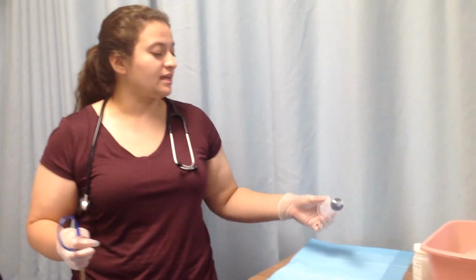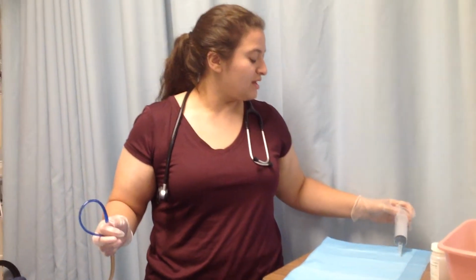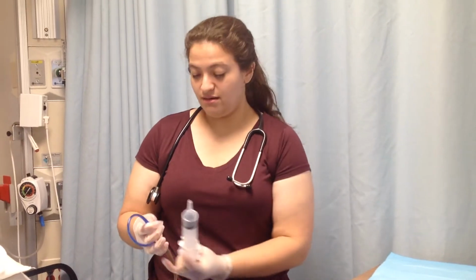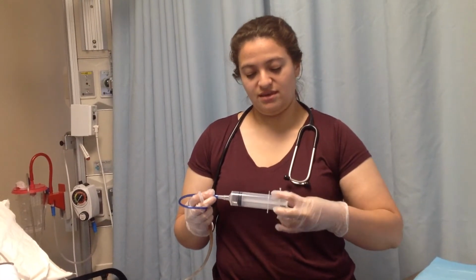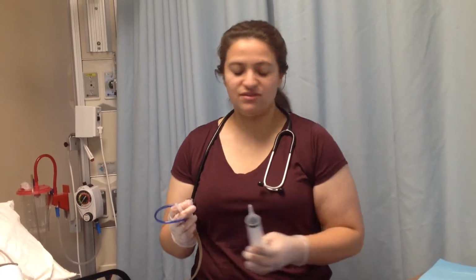And then once I'm done with that, I would irrigate the blue vent with air. So I'd clean up again with the dirty side of my blue pad. And then I would take 10 milliliters of air. It's about there. And then I would take this blue side and cap that side, and make sure to insert with air. That's just to help clear any suctioning or anything, and so forth.